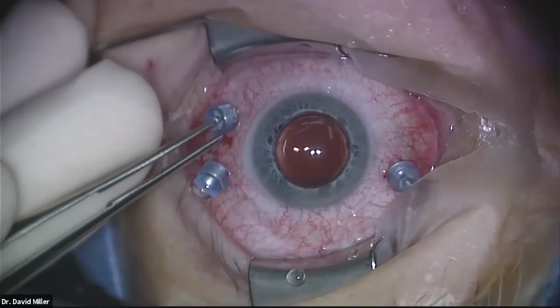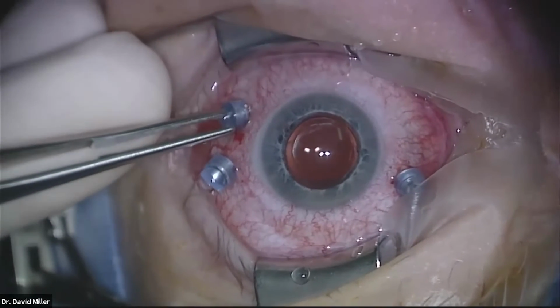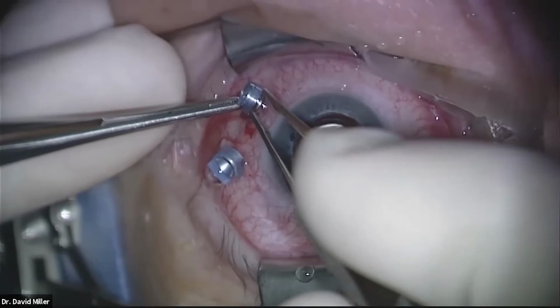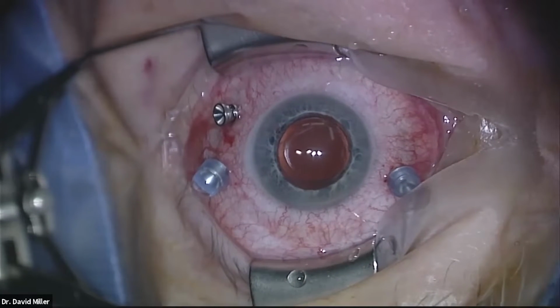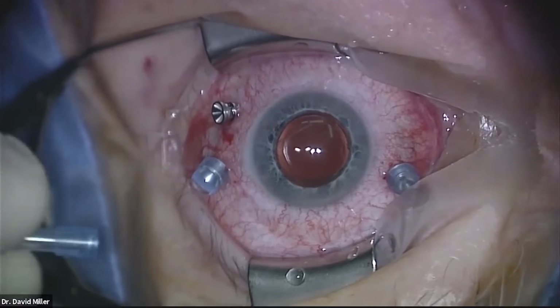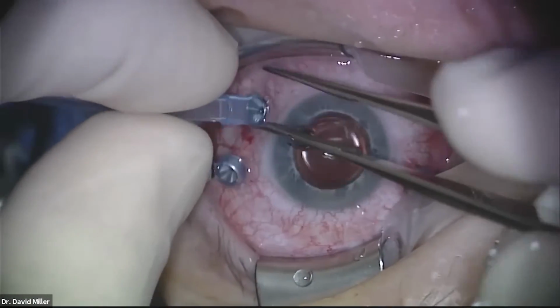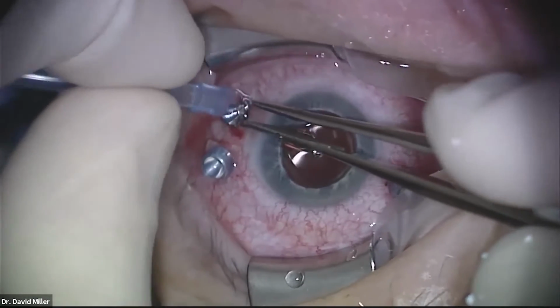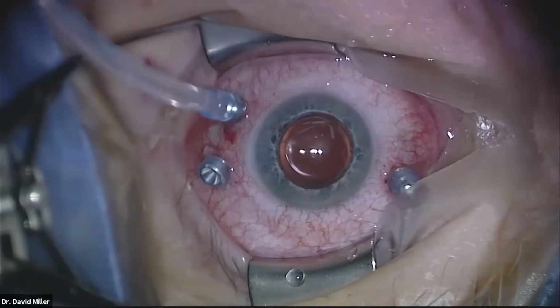So now all the cannulas are in with the valves. I'm going to pull this valve off. You got it up there. Sometimes they're a little sticky. We just pop that off. There you go. Turn our irrigation on. Take a look here. We're going to tape that into location there.